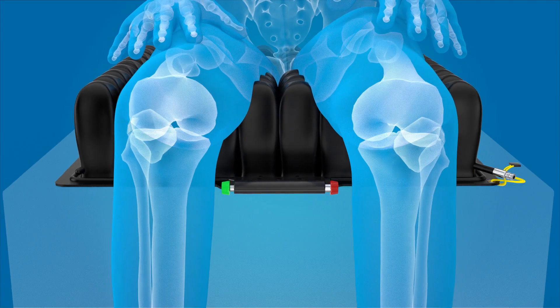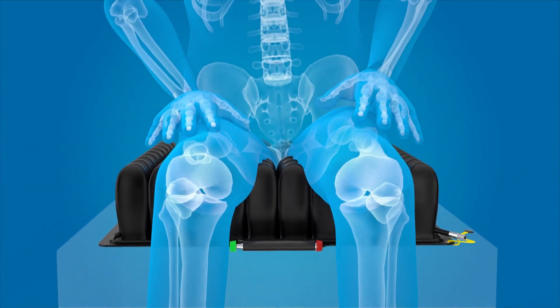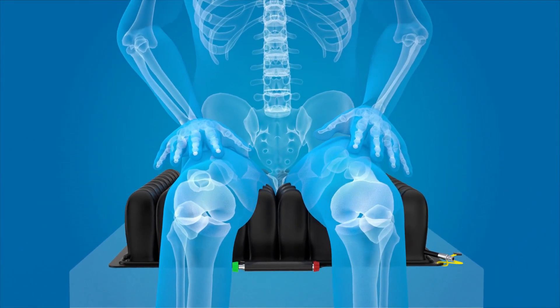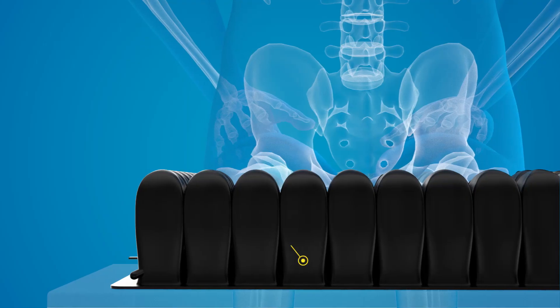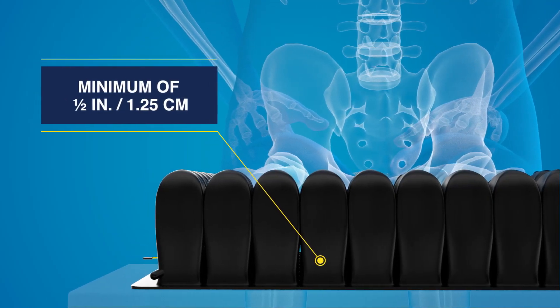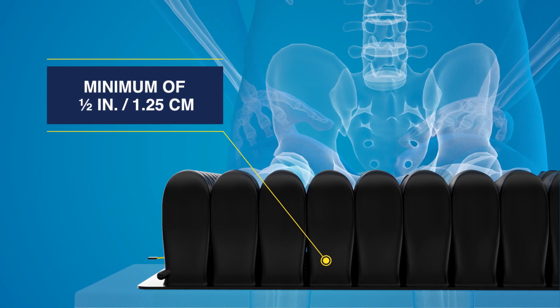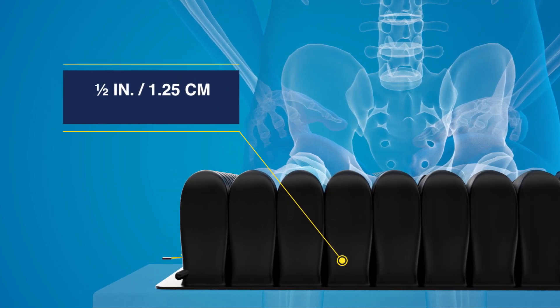Close the isoflow control by pressing the red knob in. Perform a hand check to ensure there is a minimum of one-half inch of air between the client's ischial tuberosities and the seat surface.